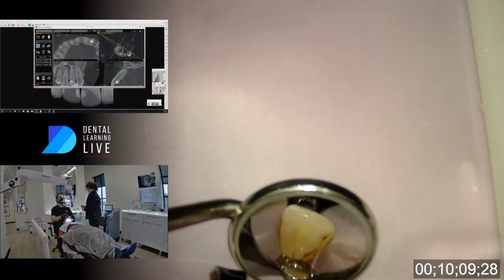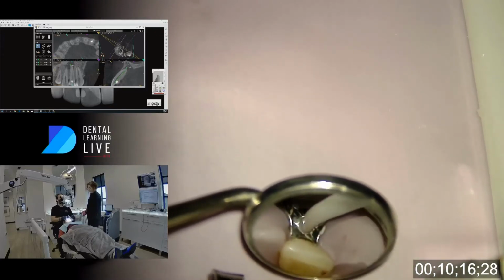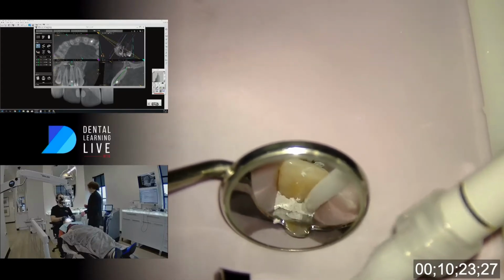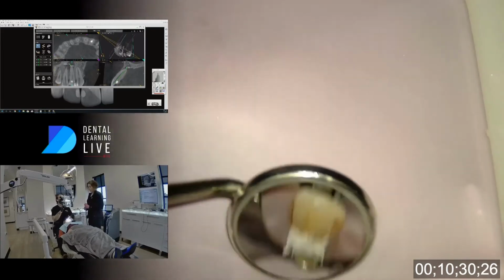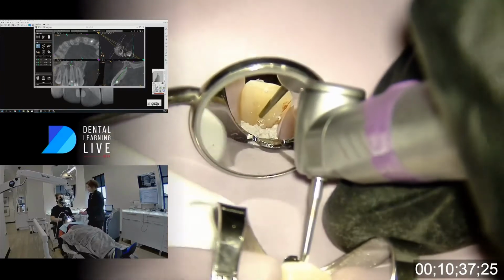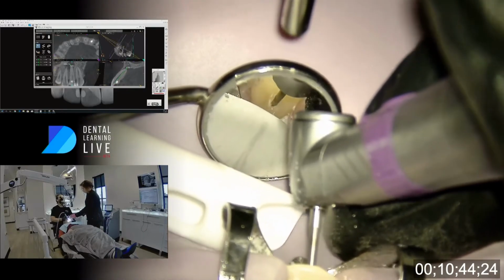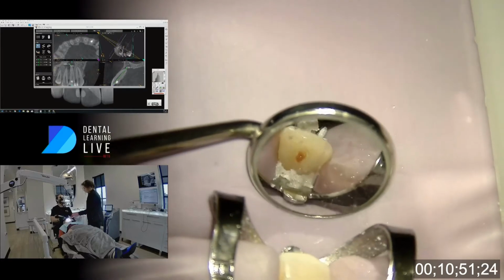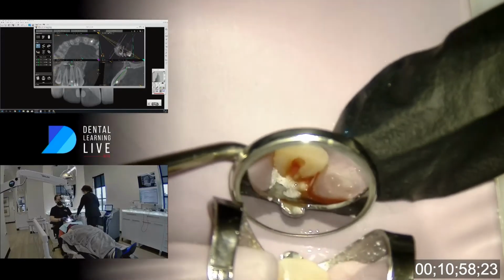Putty. Now, kind of carry over from residency, I always just do kind of a double seal technique. Nothing's worse than taste. And so we're just going to seal around this just a tad bit. There we go. All right. Let's take a look inside here. How are we on focus, lens? Looks like. Okay. All right. So, clearly we got a lot of pressure coming out of this.